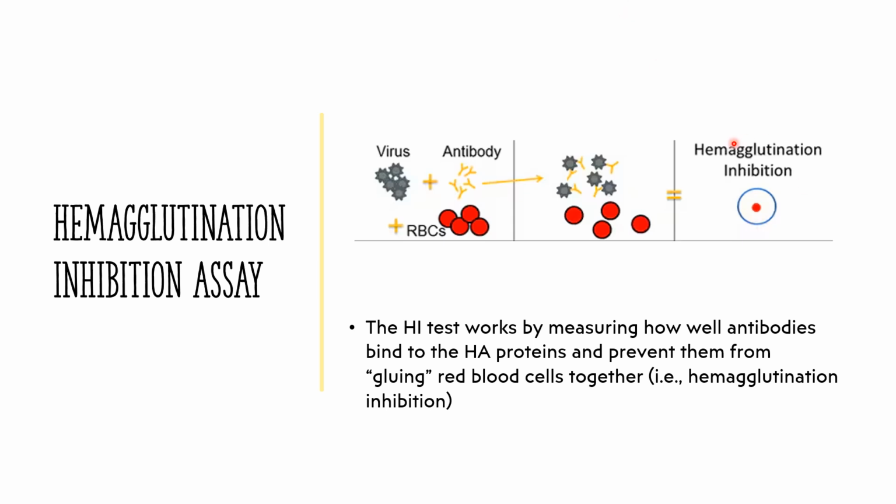This figure shows what hemagglutination inhibition looks like in the well of a microtiter plate.